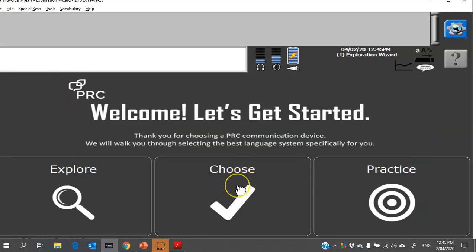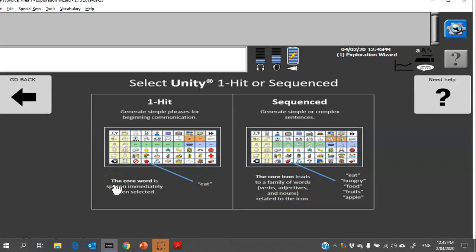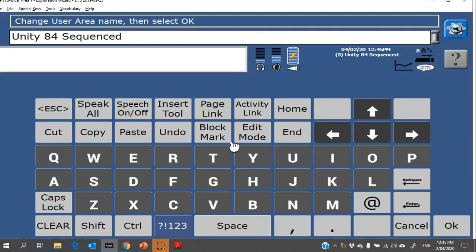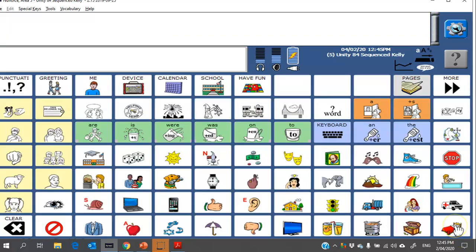Back on this screen I can go to Choose and today I'm going to choose Unity Sequenced 84. At this point it will ask you, do you want to change your user area? Normally I leave it how it is, but I just add the person's name at the end so that I can locate that user area in the menu later on, especially it's important for backing up the device. I can see which one's mine and then I click OK.